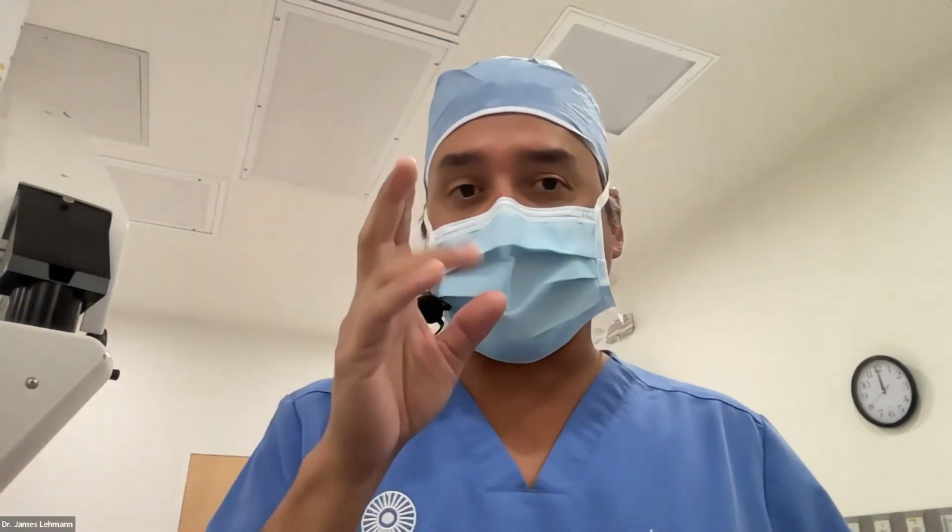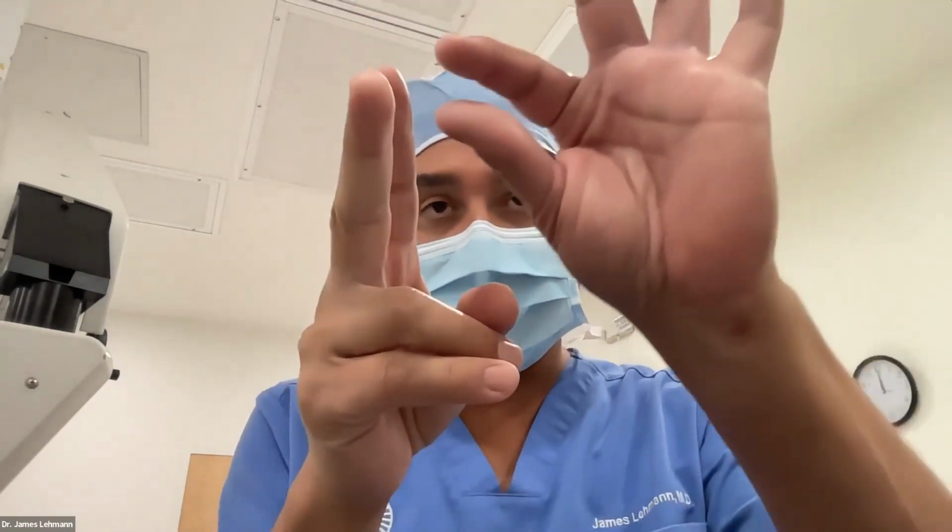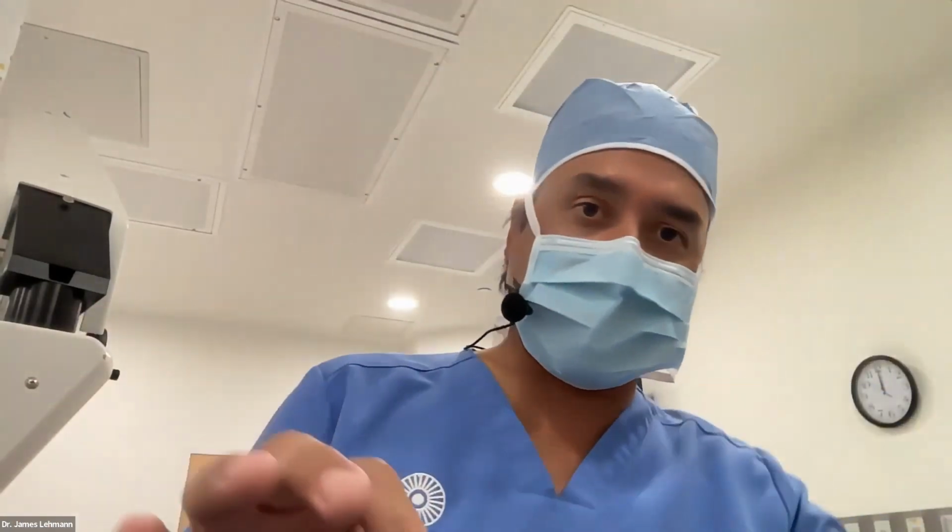If you have too small of a Rexis and you're like, I can't operate on a 2 millimeter Rexis, then you have to go across the chamber, make a little snip with some Vannas or some intraocular scissors, and then you grab each side of those leaflets separately, one at a time, and then you peel it back circumferentially so that you can enlarge that Rexis.